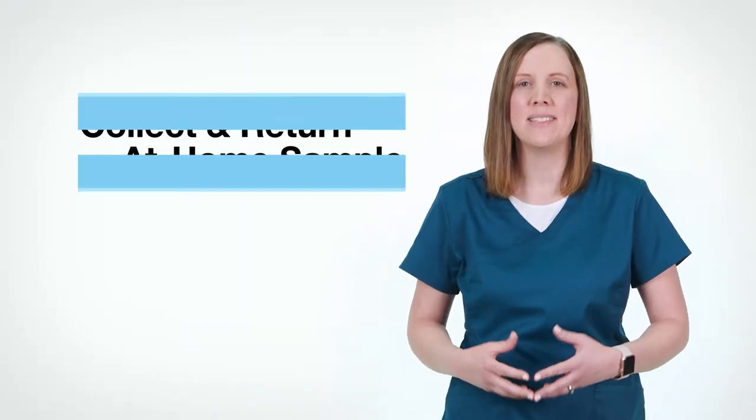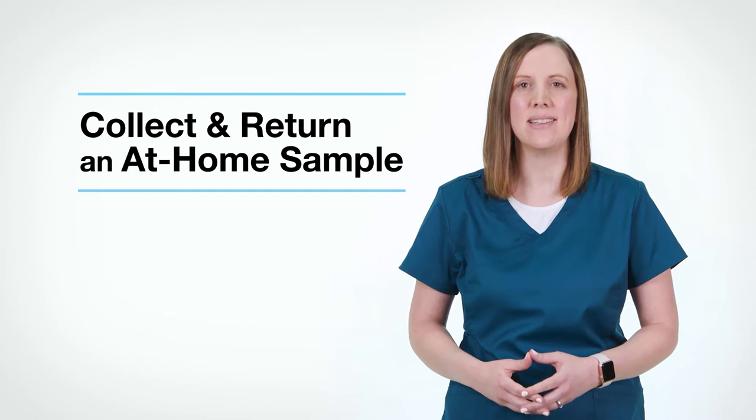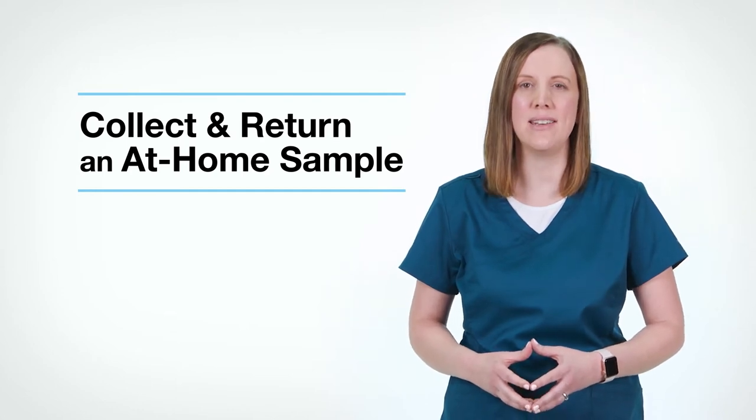Hi, my name is Erin and I'm a registered nurse. Today I'm going to show you how easy it is to correctly collect a COVID-19 nasal swab sample.